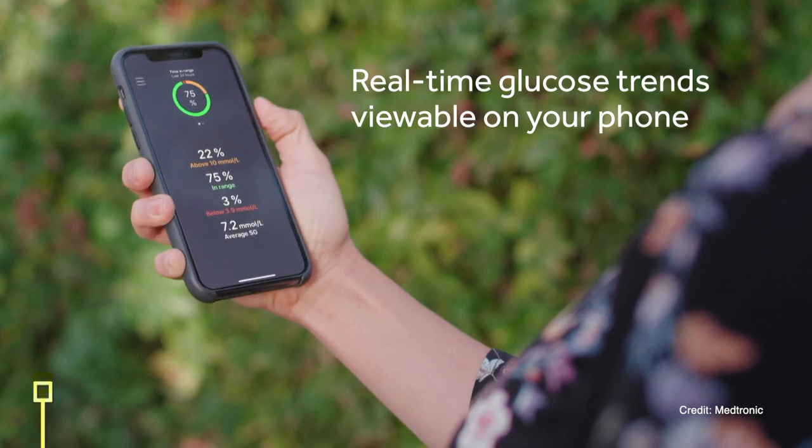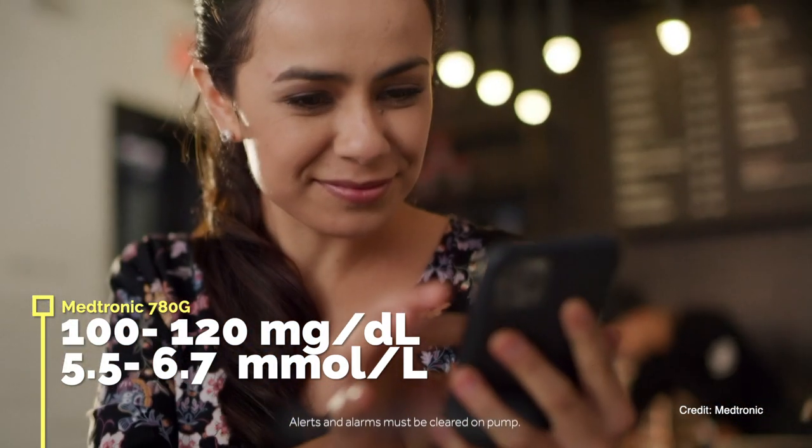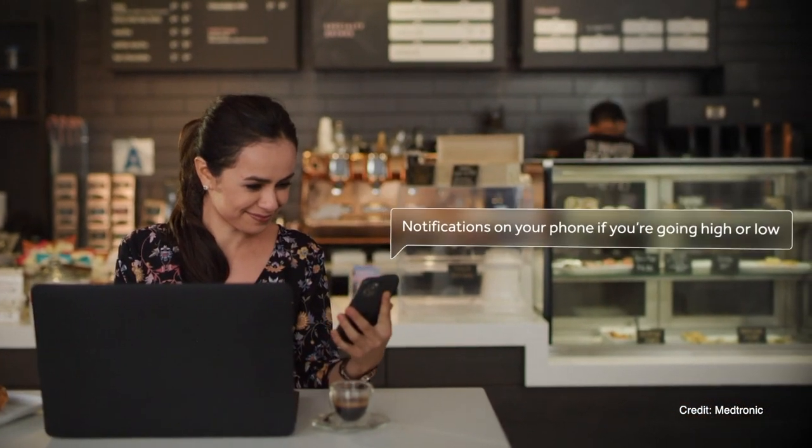Last but certainly not least: Medtronic. Makers of the first ever hybrid closed loop system, the 670G. Their most current hybrid closed loop is the 780G, which has been rolled out across Europe and will be coming to the US as a software update to the 770G in the coming months. The 780G has a customizable target glucose between 5.5 and 6.7 mmol/L and it has correction boluses. If you want to learn more about Medtronic's 670G, 770G, and 780G and the differences between them, I've done a video about Medtronic's pumps which you can watch here.